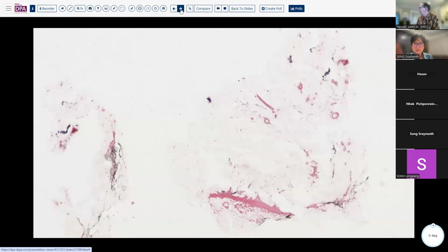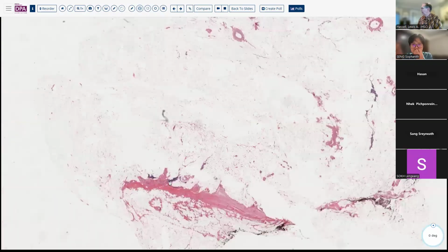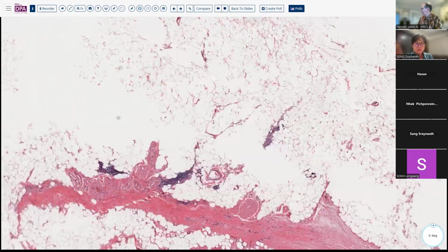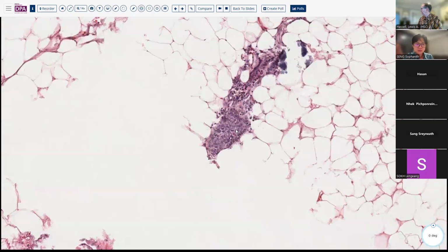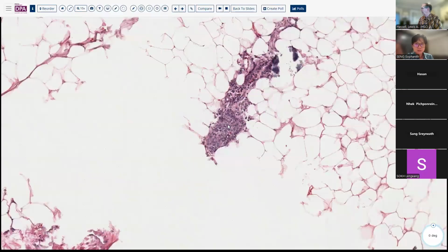Another possibility in the thymus, of course, is that you develop what's called a thymolipoma. And in that case, you may again have very limited or minimal residual thymic tissue and just a replacement by fat. This is very much a disorder where you need to be very suspect of little areas like this as being small thymic remnants. Here we don't see a Hassall's corpuscle per se, although there may be a little bit of an epithelioid appearance here that would be characterized by thymic epithelium.